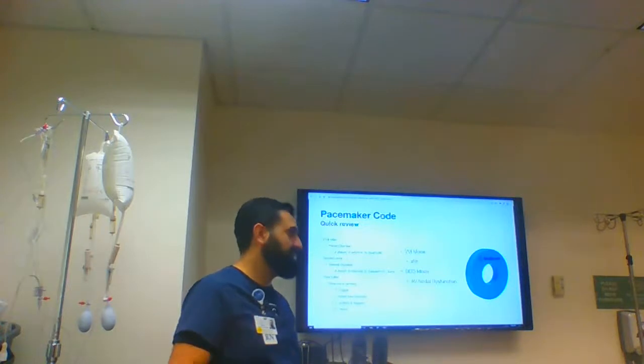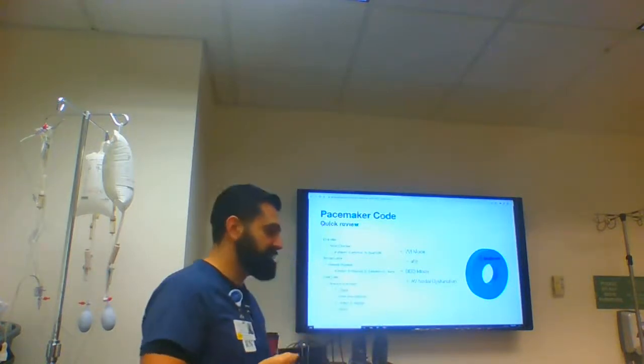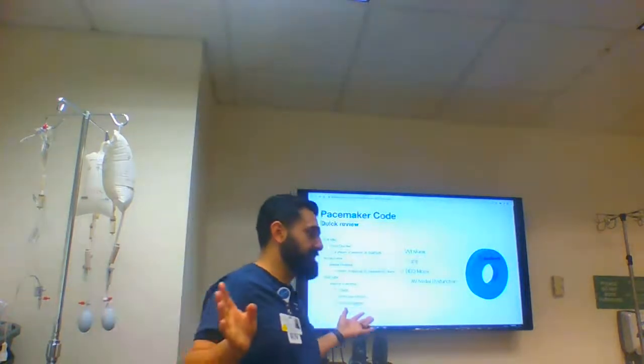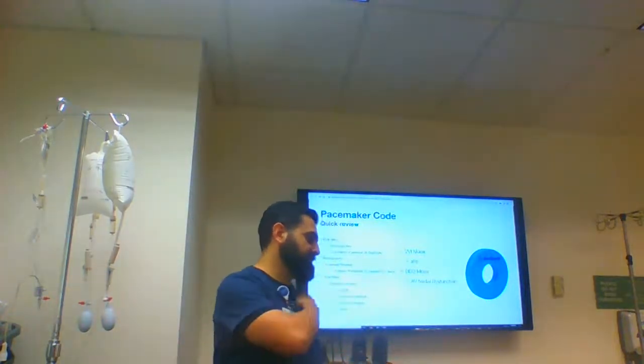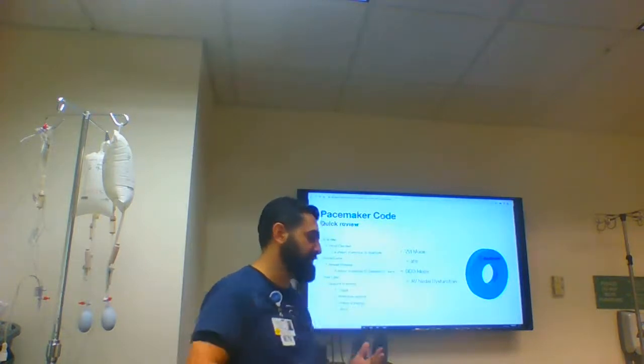correct an arrhythmia. If you have a patient on comfort measures, your patient's not going to pace forever. Just know that you don't need to put anything on the patient. You don't need to worry about not correcting an arrhythmia.